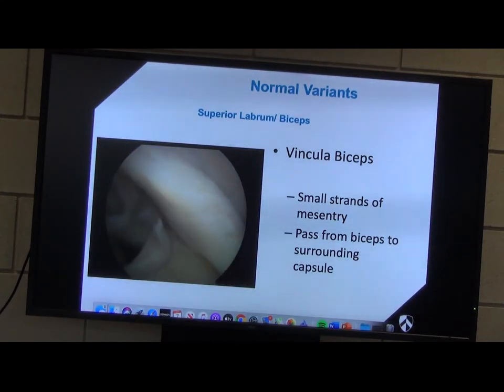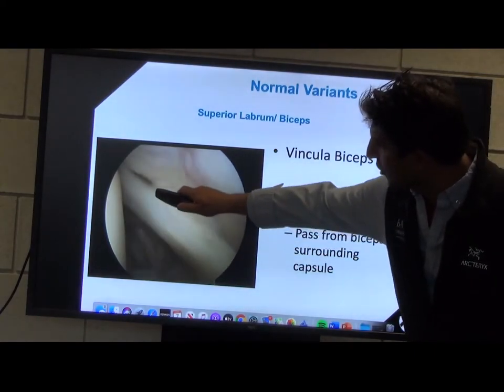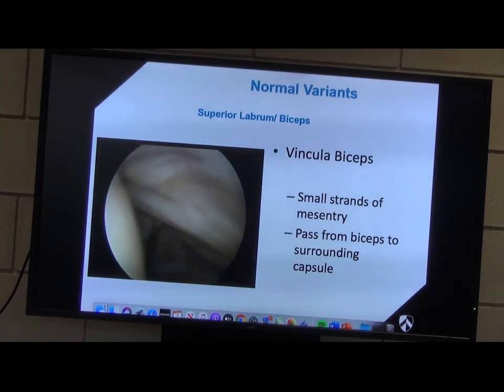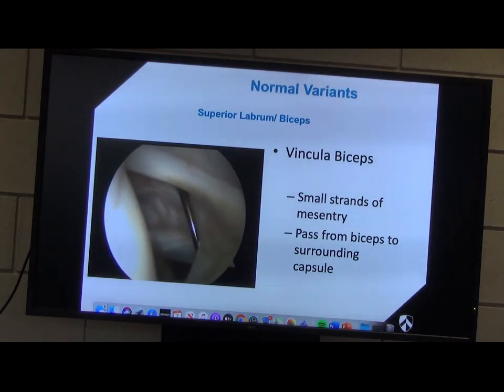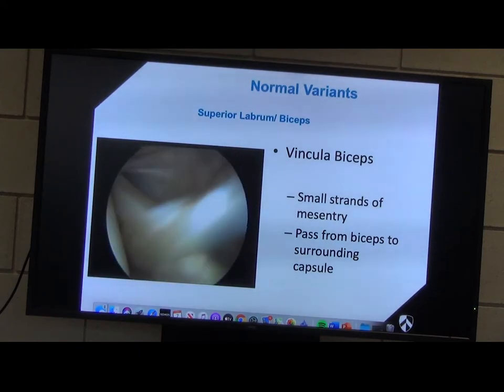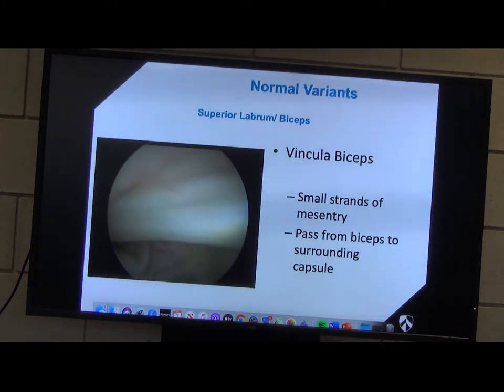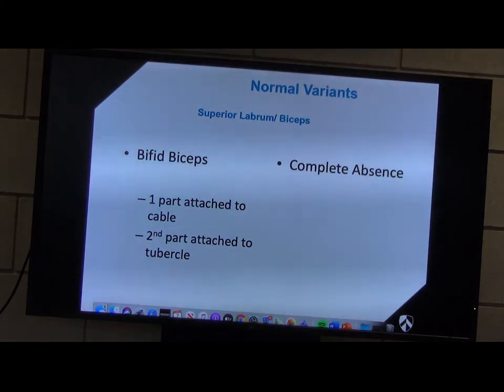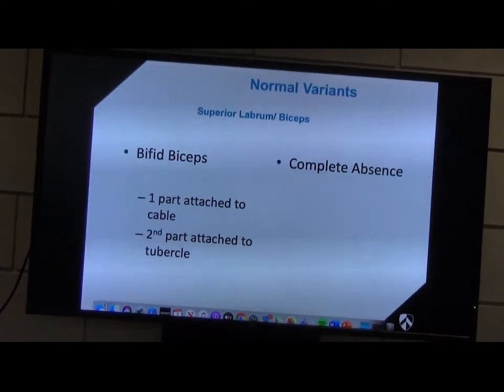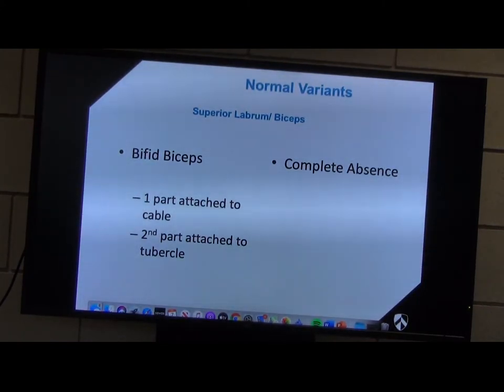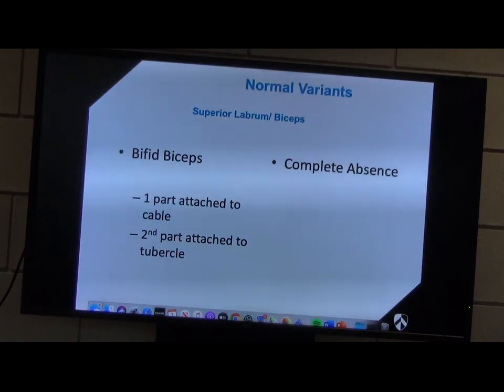The biceps can be abnormal as well. If you look at this biceps, it's actually got a membrane attaching itself to the capsule — this is called a vincular biceps, a normal variant. In this individual I ended up tenotomising the biceps because I think it was causing a problem. They've got a cord-like middle glenohumeral ligament. The extra-articular portion of biceps is normal here. You can also have a bifid biceps — that's pretty rare — where one part attaches like that vincular and the other part is attached to the glenoid labrum. Complete absence of the biceps — I've seen that a couple of times.